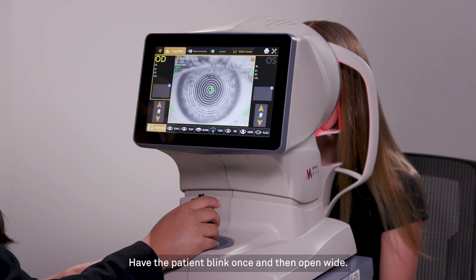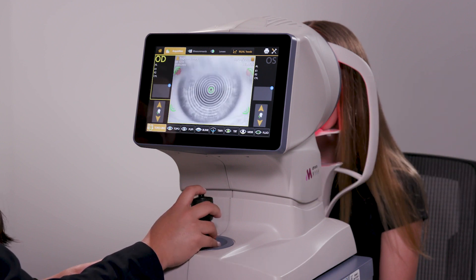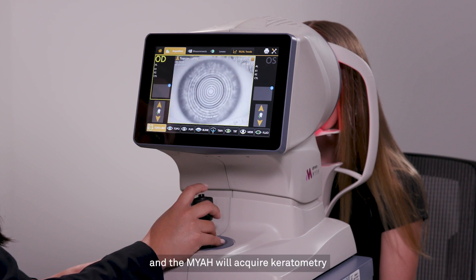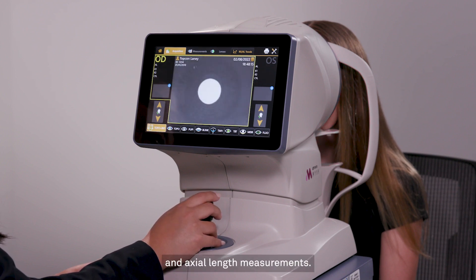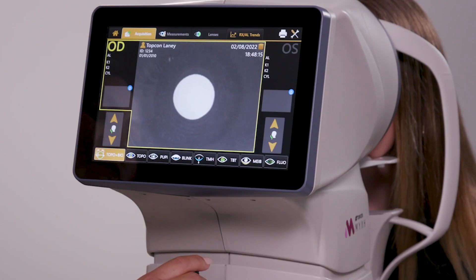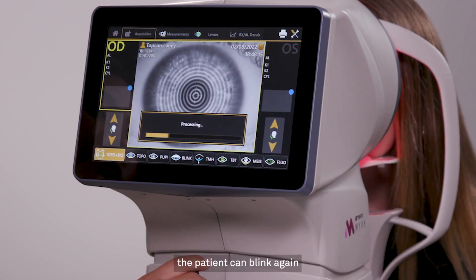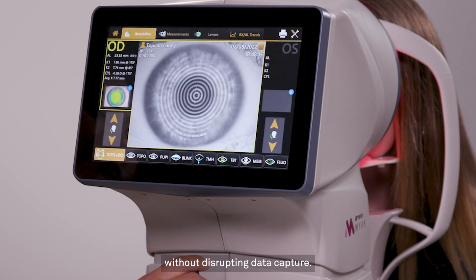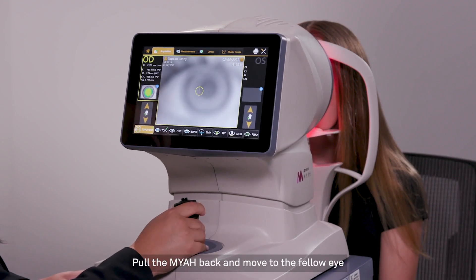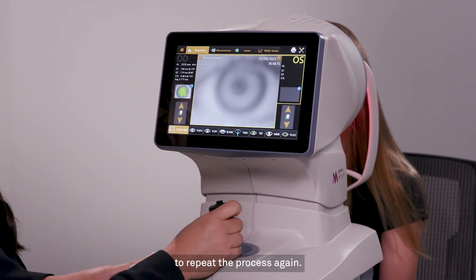Have the patient blink once and then open wide. Push the button again and the Maya will acquire keratometry and axial length measurements. When the word processing appears on the screen, the patient can blink again without disrupting data capture. Pull the Maya back and move to the fellow eye to repeat the process again.